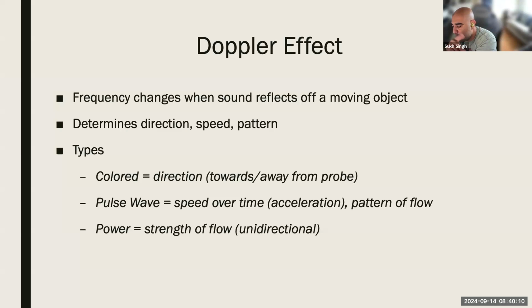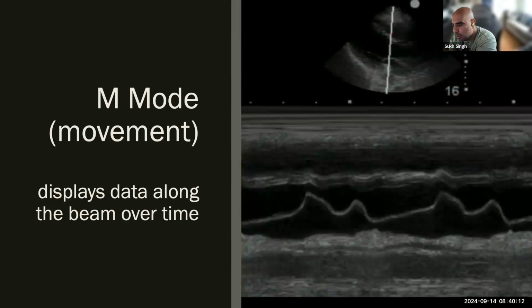Yeah. So in that one, it's like the mitral valve is going up and down, and that's what you see. So on the x-axis is actually time. So it's the mitral valve moving over time. And so you can use stuff like this to tell when you're in diastole or systole. And there's a few unique uses to it. Won't use it that often, but definitely this is the time to learn about all these different modes.